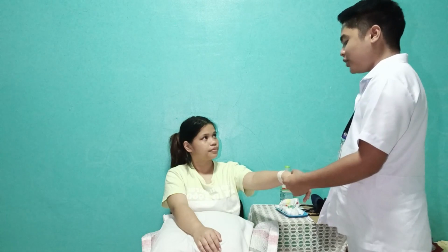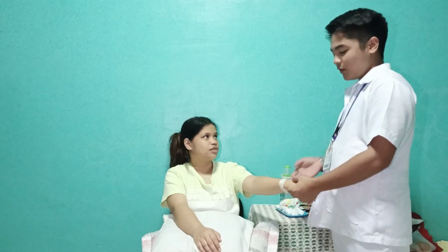Good day, ma'am. My name is Gerald Ababa Bisera, ma'am, your student nurse for today. So ma'am, I will be checking your blood pressure. Is that okay with you? Yes. Okay, ma'am. Can you please show me your wrist? Okay, ma'am, can you please state your name? Aya Alba. Okay, ma'am Aya, can you please state your birthday? November 16, 2000. Okay, thank you, ma'am.